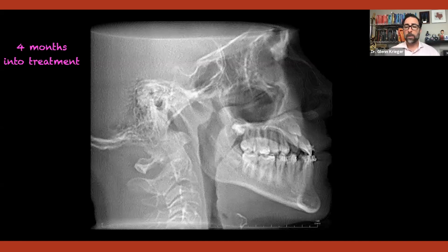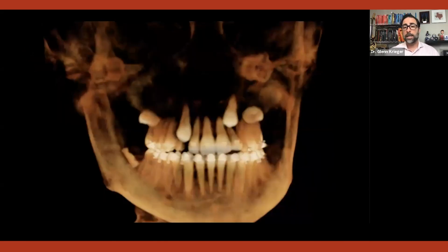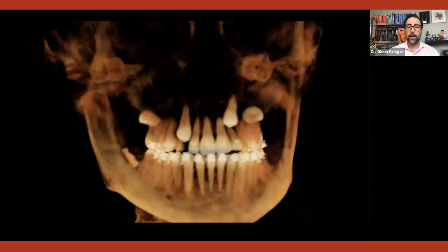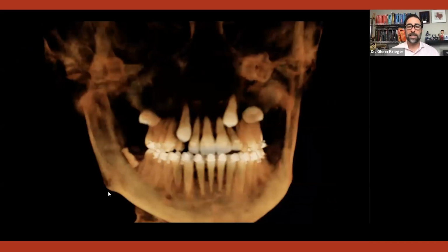It's not bad, right? It shows me kind of where the cuspid is relative to the lateral, but is that the right side lateral, the left side lateral, right? Our tooth is certainly coming into a better position than it was to begin with, but I need to see a little bit better. So let's see what we've got here. Now I've got separation, right? Oops, sorry, I'm going to go back here for you. Sorry, I keep going back.